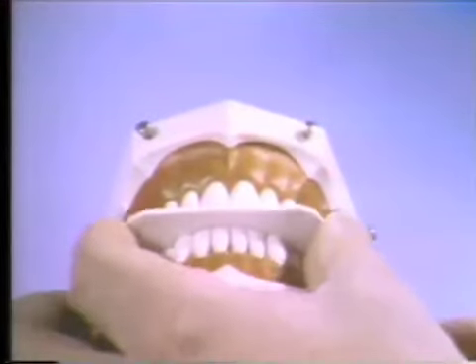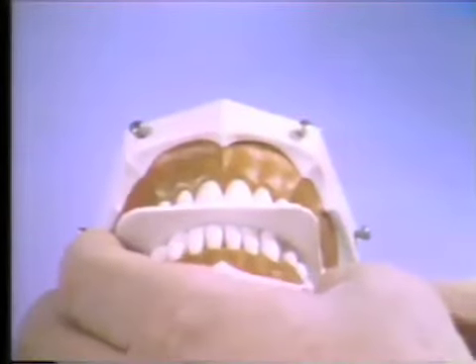Using the typodont for demonstration, the film packet will be inserted in the mouth with its long dimension extending from front to back. The sensitive side of the film is placed downward against the lower teeth, and the packet positioned symmetrically in the mouth. It is held in place by the patient with a gentle biting pressure. After exposure, the film is carefully removed.